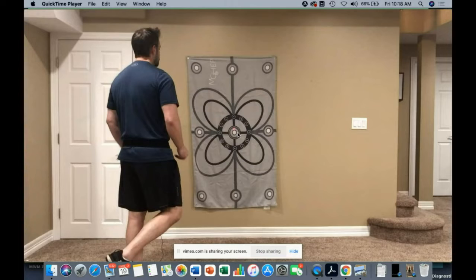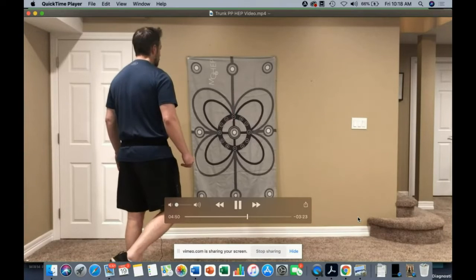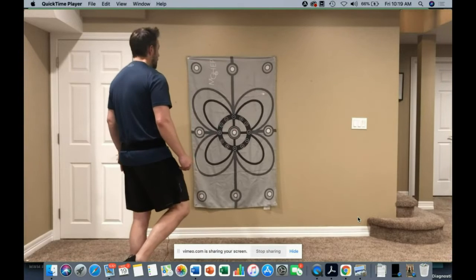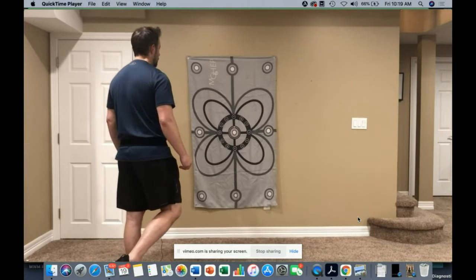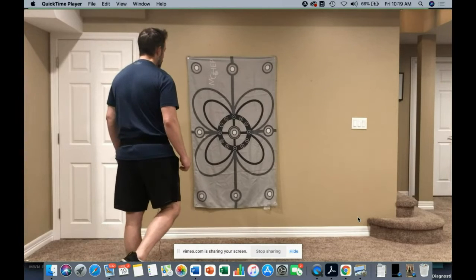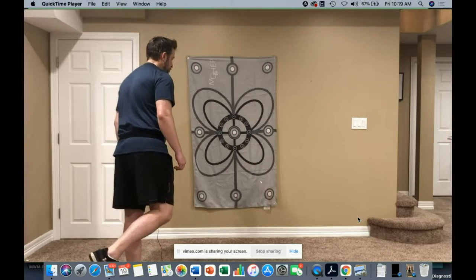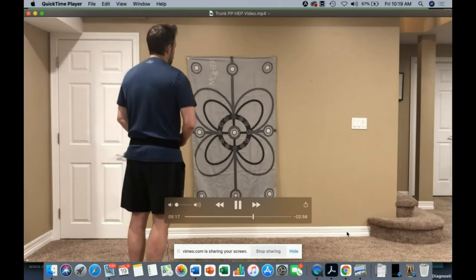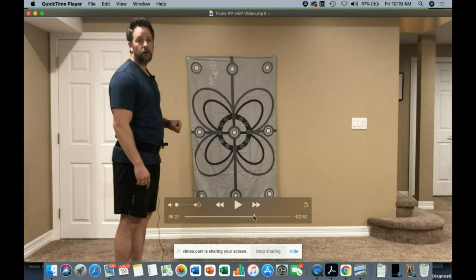So making the balance more engaging for your patient can yield improved results for them. So going through a pelvic tilt, going through hip range of motion there, and then combining those types of things, right? So getting more dynamic with your balance applications. Can you even force them to really go through large excursion movements like you saw there? And of course, you could do some cognitive overlay with these things as well. This can definitely promote some more advanced applications orthopedically, as well as you have a person who maybe has an ankle sprain and they're recovering.